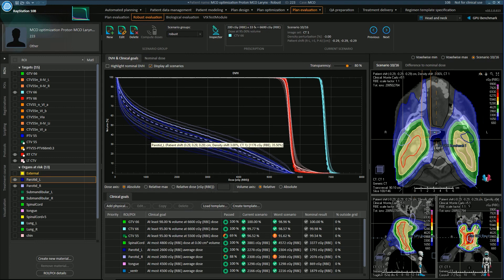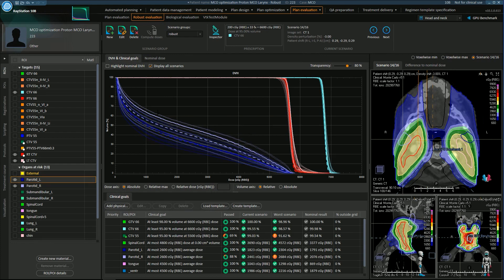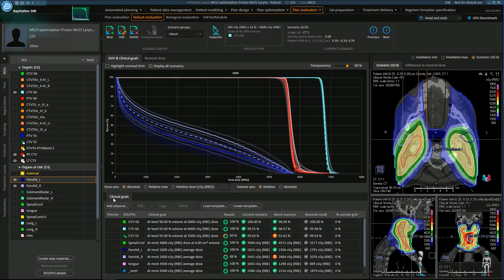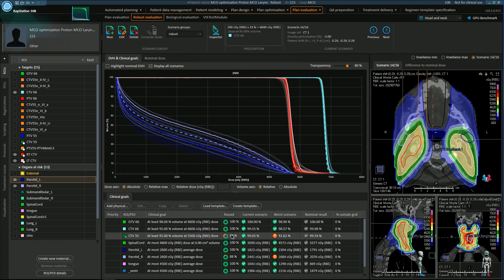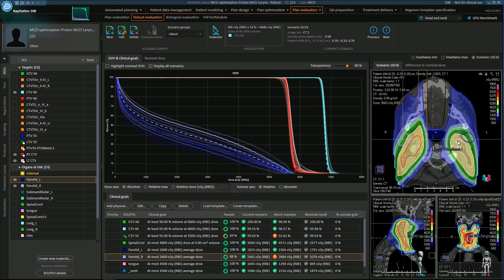The tools we give you to evaluate the plan include the DVH band for the ROIs. We can click through each DVH curve and the corresponding scenario will be shown in the 2D view. We also have clinical goals, where we can see the percentage of scenarios that have passed the clinical goal. We can see that for CTV55 there have been some failures, and also for the Parotids — that is because of the conflict between reducing dose to the organ at risk while achieving optimal, robust target coverage.